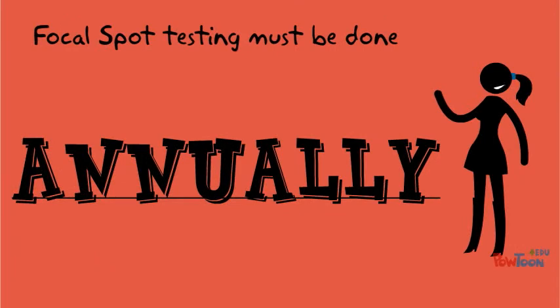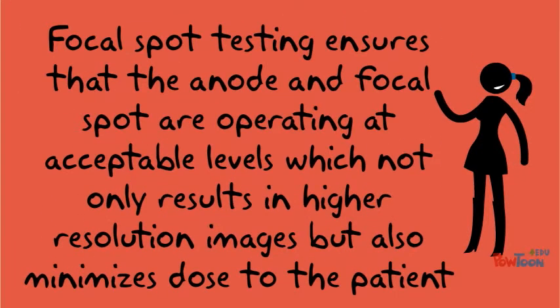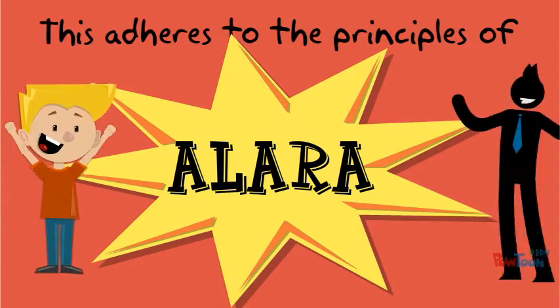Focal spot testing must be done annually. Focal spot testing ensures that the anode and focal spot are operating at acceptable levels, which not only results in higher resolution images, but also minimizes dose to the patient. This adheres to the principles of ALARA!